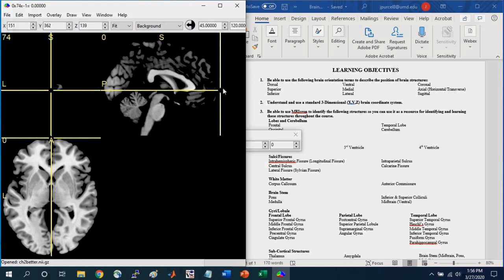I'm going all the way anteriorly here in the sagittal orientation. You can see that that's a positive 74. So to get the entire length of the brain, you would just add 74 to 106.